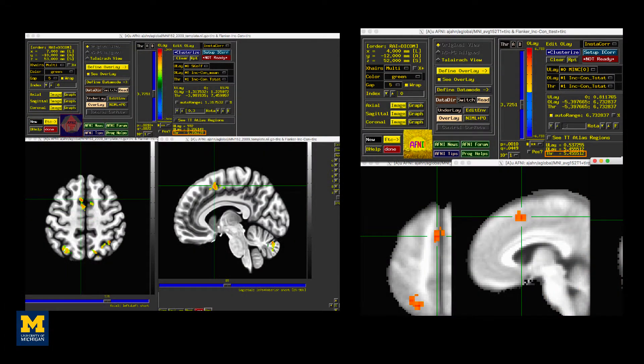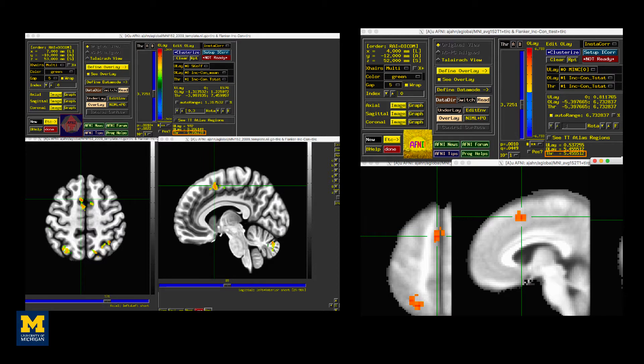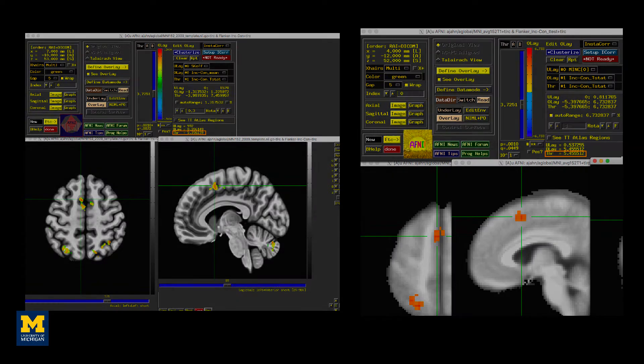Using the same thresholding, you can see the results for FMRI prep on the left and AFNI on the right. The pattern of the results is very similar and the strength of the effect is slightly stronger in the FMRI prep results than it is in the AFNI results.